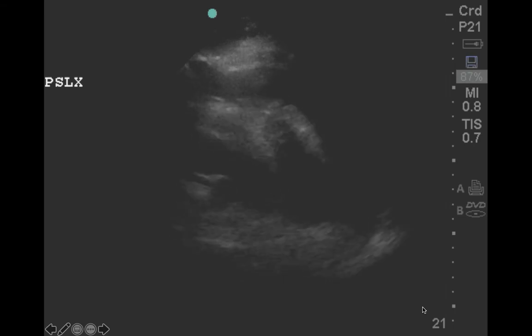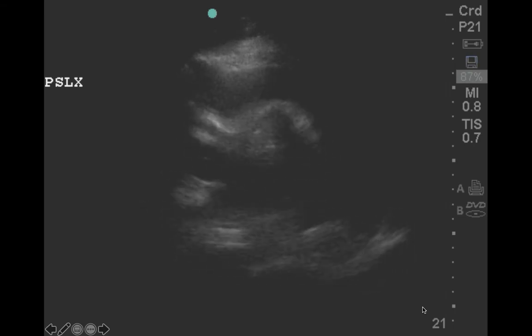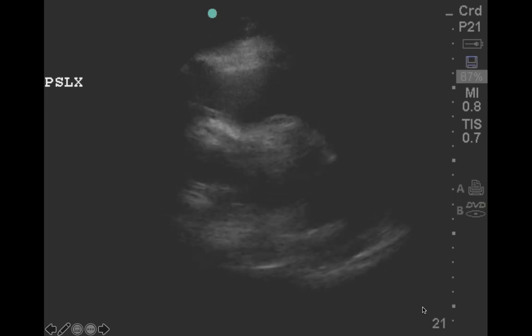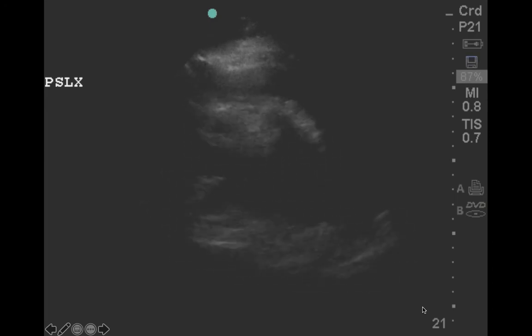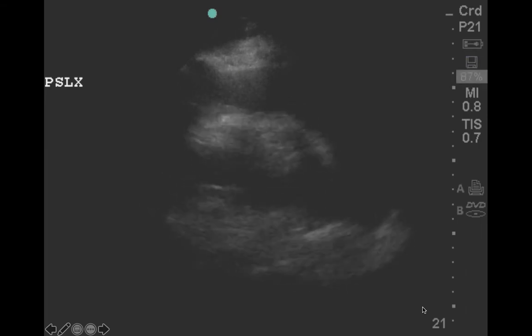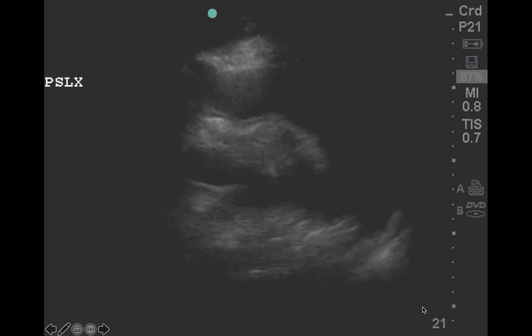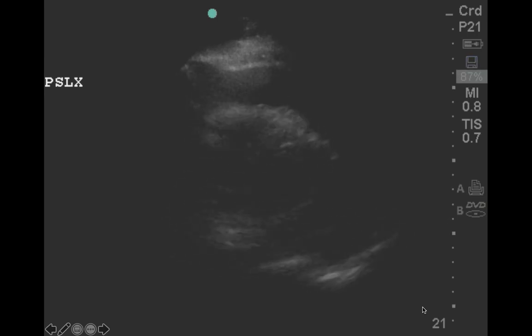In this video of the heart, there is definitely a large pericardial effusion present. But look at the right ventricle at the top of the screen. Notice how the free wall of the right ventricle depresses with every heartbeat. The free wall looks like a trampoline with some guy just jumping on that outer wall, depressing it inward. This is tamponade.